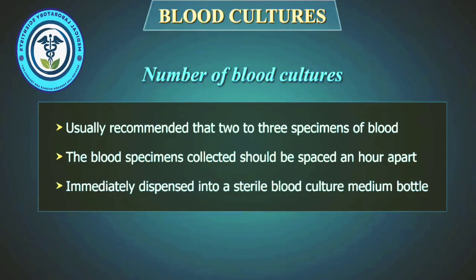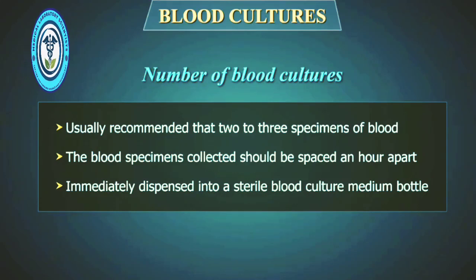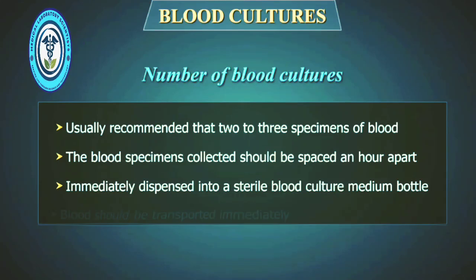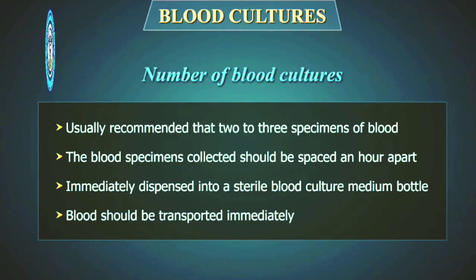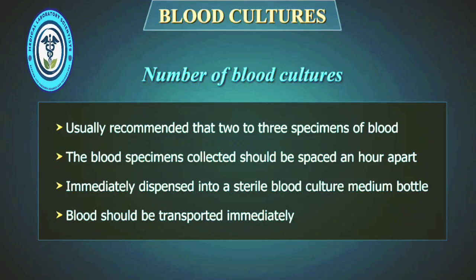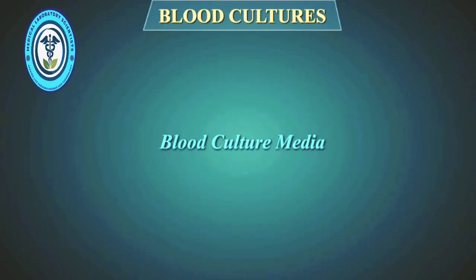It should be immediately dispensed into a sterile blood culture medium bottle, which can be obtained from the microbiology laboratory. The blood should be transported immediately to the laboratory, where it can be placed in the incubator or an automated blood culture instrument. Blood culture media.